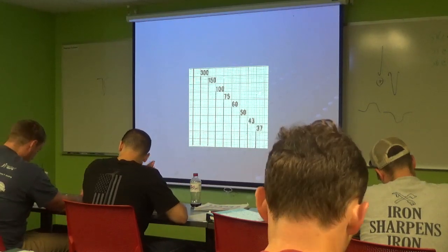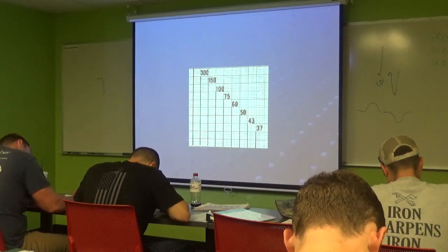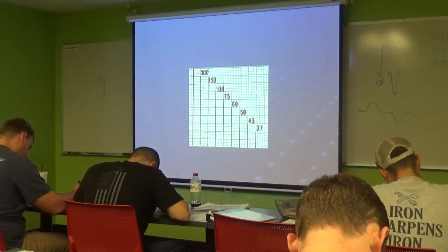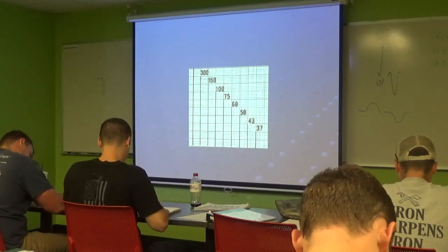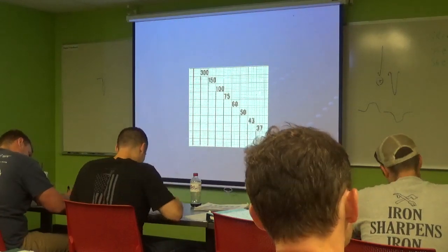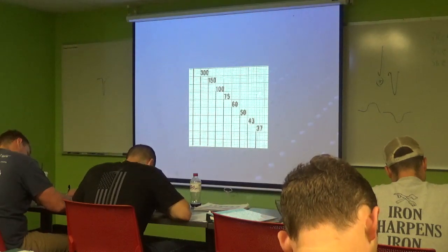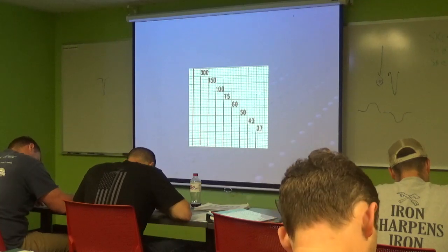I'll keep working on these at some point, but just another minute so we can get on to the MI part, the juicy part. Now, the one that's the VTAC, we're not going to have interval stuff to worry about there. That was straight up just VTAC at a rate of whatever.